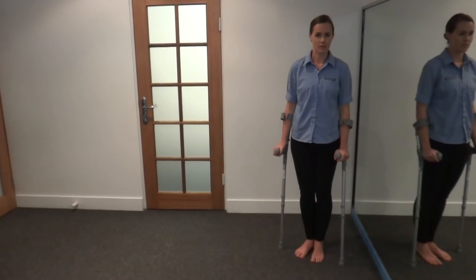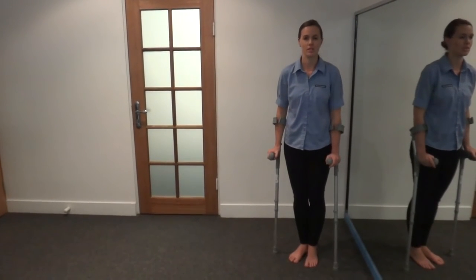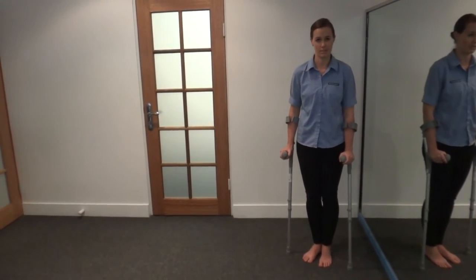I'm going to demonstrate how to do touch weight bearing with crutches. Touch weight bearing normally means about 5% of the body weight going through the foot — basically just enough to place your foot down, get some proprioceptive feedback through the foot, and it assists with some balance.